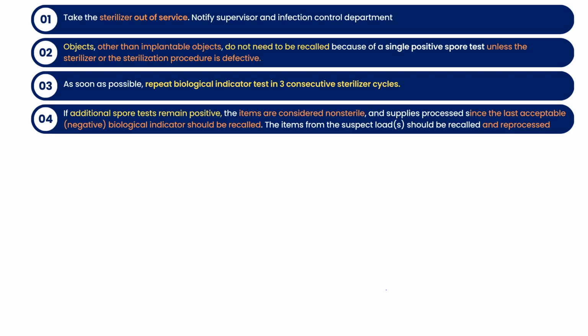in 3 consecutive cycles. If any of them is positive, then you have to consider all the items non-sterile and not acceptable, so they should be recalled. They should not be used, and they should be reprocessed with an effective sterilizer.